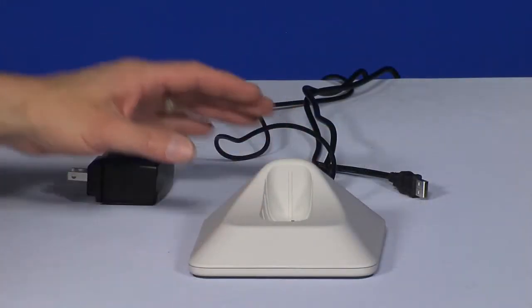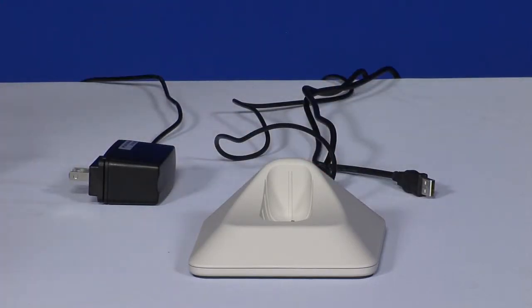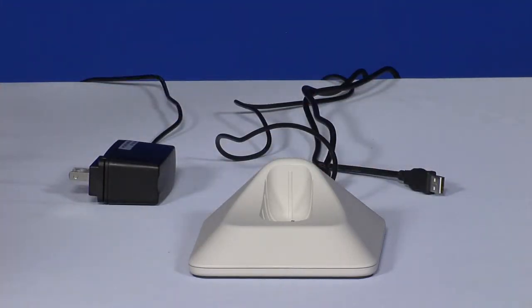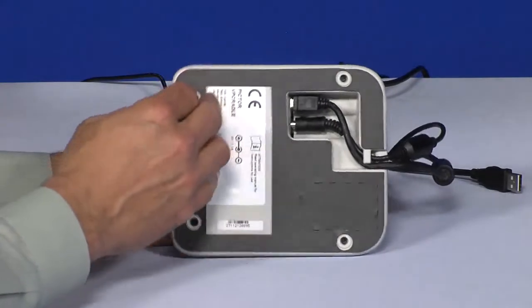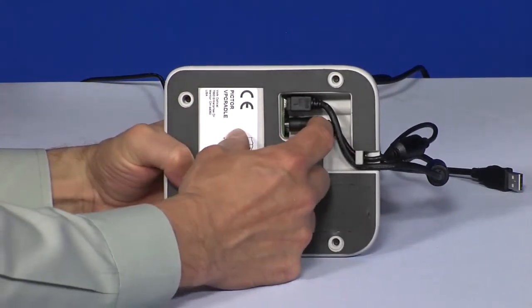Here we can see the cradle, power and USB cords. Pigtor is both charged and connected to the computer using the cradle, which synchronizes with your computer via a USB connection to upload and review the images. The computer connection is a standard USB connector. Both cords connect beneath the cradle. Make sure they are firmly inserted into their respective connections.